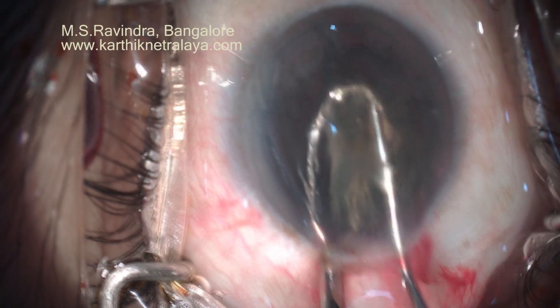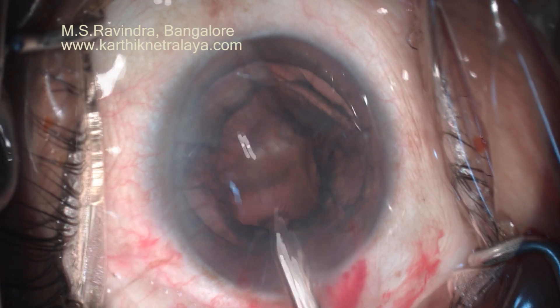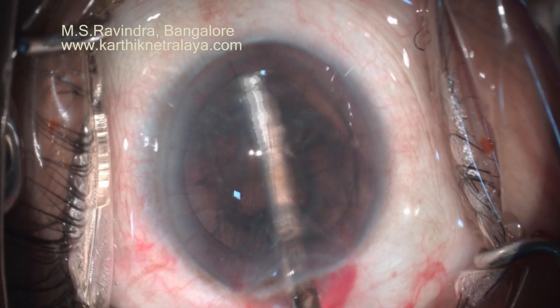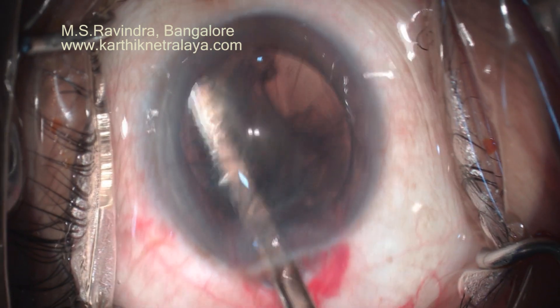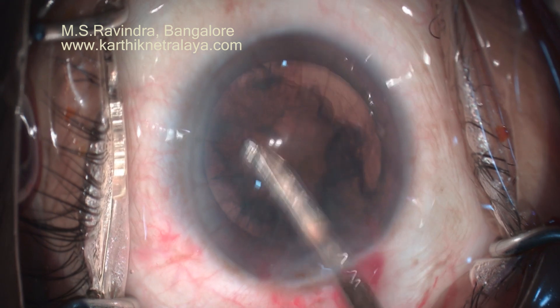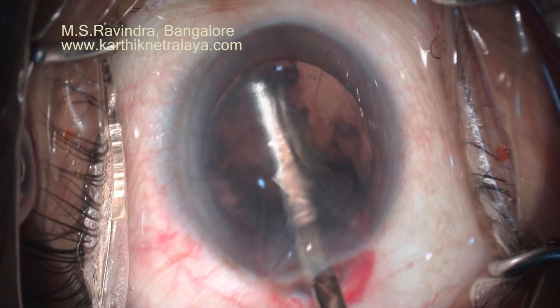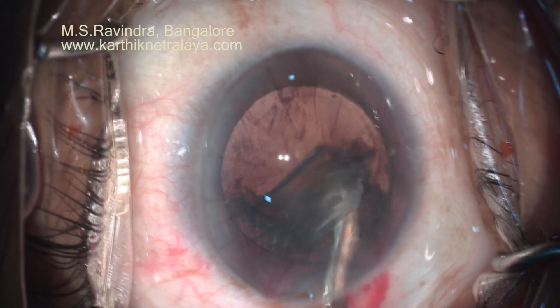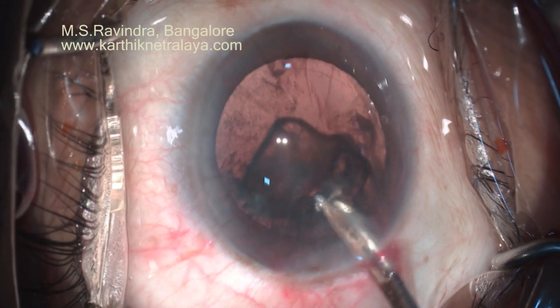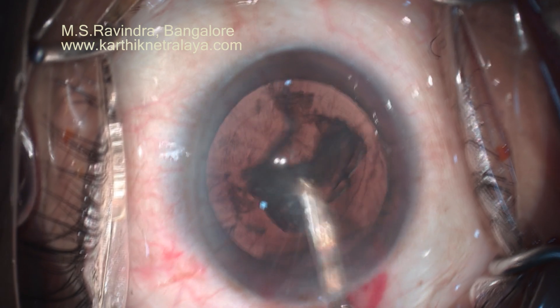The aspiration of epinucleus — in this case there is a certain amount of epinucleus because the hydrodissection did not happen the way intended; it was a hydrodelineation. You saw the golden ring. Anyway, being a soft cataract, it was very easy to remove the cortex. The debris stuck on the posterior capsule is polished with the back of the Simcoe cannula.